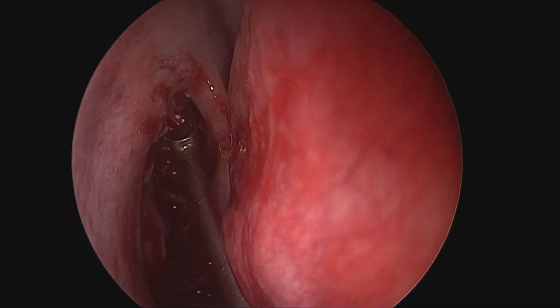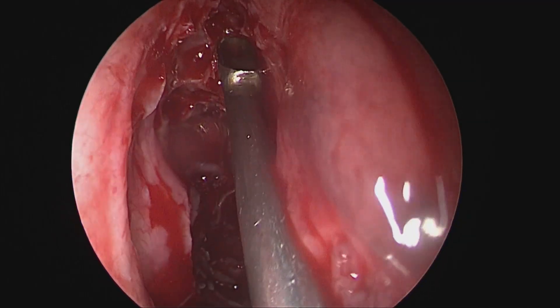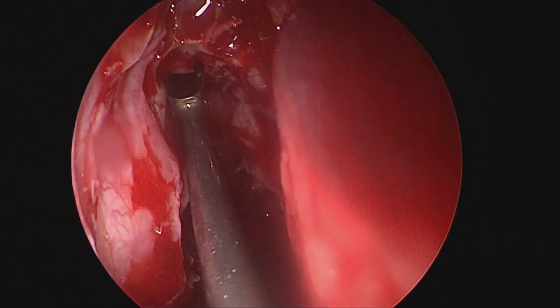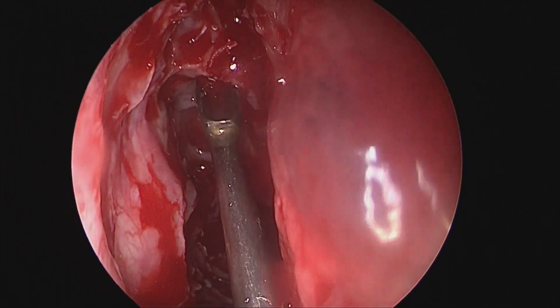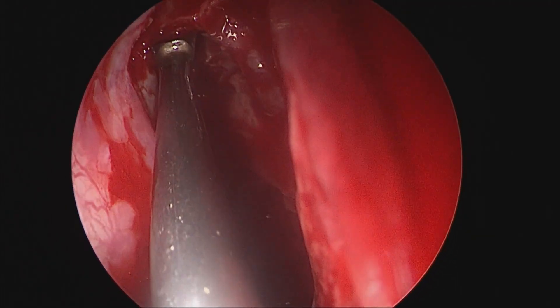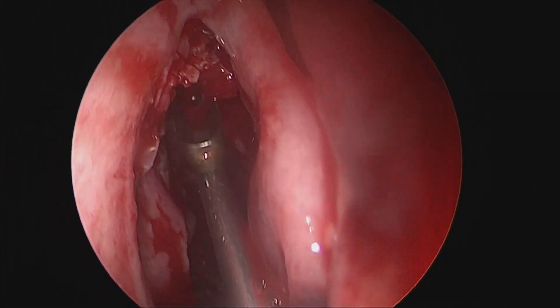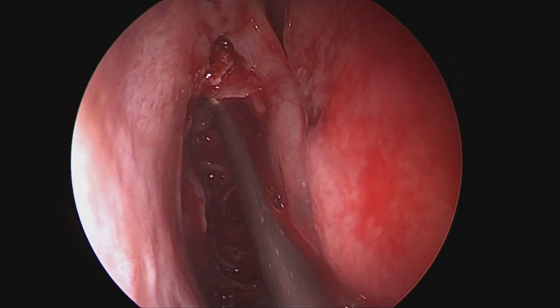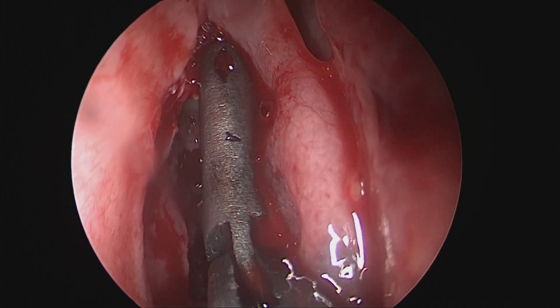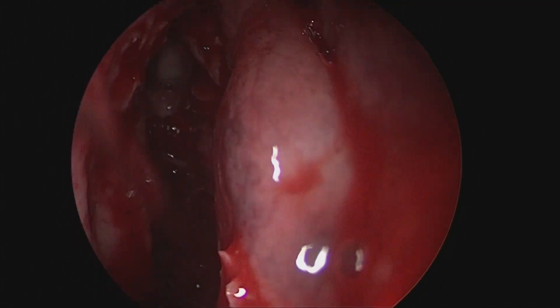As we remove the anterior wall of the agger nasae, we achieve a more straight angulation of vision inside the frontal recess. We use a frontal sinus curet to gently palpate and insinuate behind the thin bone of the agger nasae cells, fracturing them anteriorly to gain good vision inside the frontal recess proper. When there are no significant type 2 or 3 Kuhn cells and only the agger nasae with a frontal buller cell, we may also remove some portion of the frontal buller cell to gain entry into the frontal sinus proper.